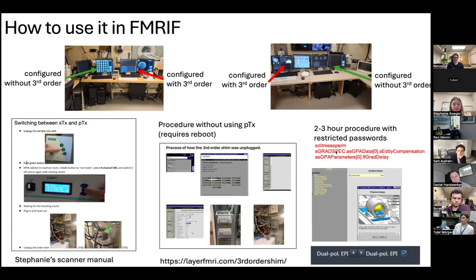The business with the short-term eddy current configuration is a bit more tricky. We still haven't figured out everything, and I guess ultimately we want to use these short-term eddy currents on the entire system for anything that's run on those systems anyway. But there are a few more tests that need to be done to be really sure that it's always an improvement to use them. And in fact, as soon as you change the eddy current, you need to redo the calibration for the delays, which is an entire procedure.